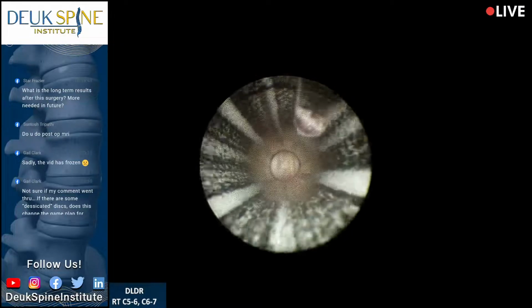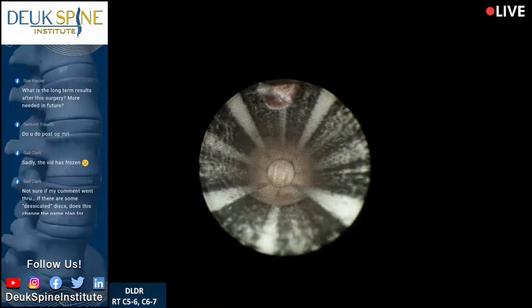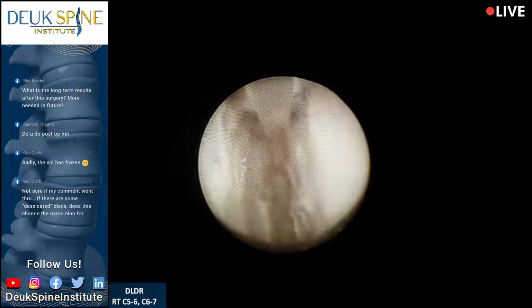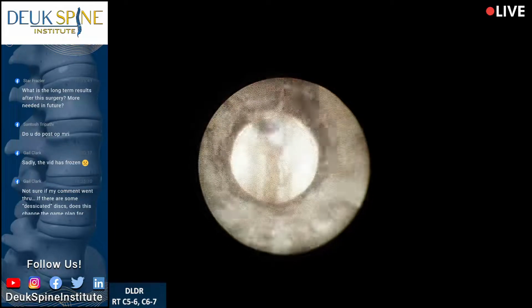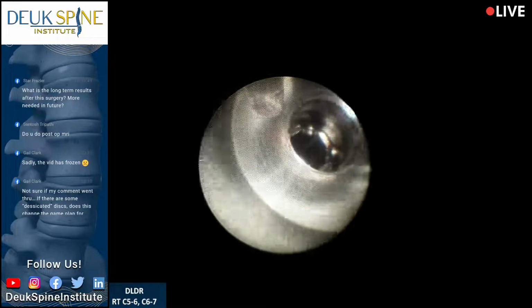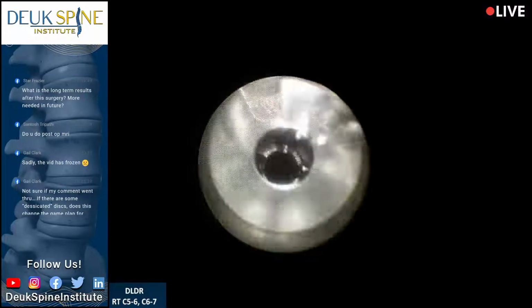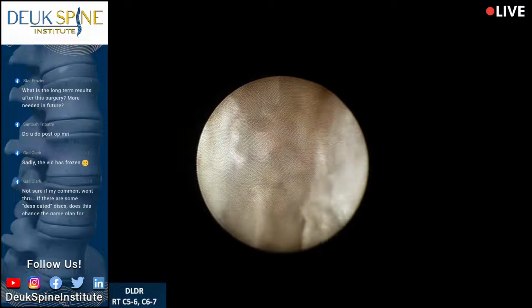I'm going to flip it. We're just about done, folks, and I'll be happy to answer any questions you have if you type them up. That way Flynn will read them off to me and I can answer them for you live at the end of the surgery. But so far everything's going well. This is a degenerative disc disease, in case you're wondering.